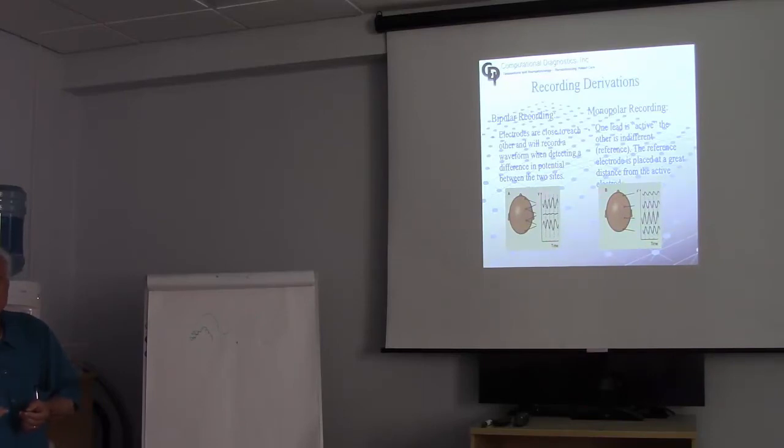In that configuration this morning, CZ is actually an active electrode. A1 is a reference electrode for CZ in the way that it's laid out, and so it's at a greater distance from the active site. I don't know if that's clear or not, but it's how you're related to the generator.